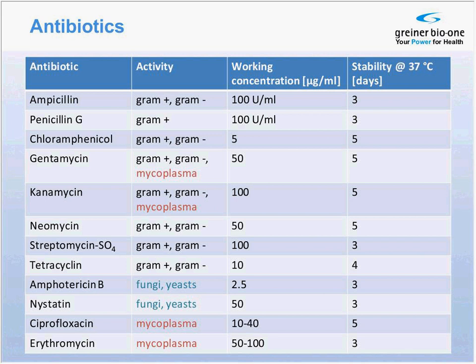The regular use of antibiotics in cell culture should be avoided because this can mask any potential contaminations. So once primary cells are isolated or once contamination is gone and also has been proven to be gone, then the antibiotic should actually be left out of the medium.